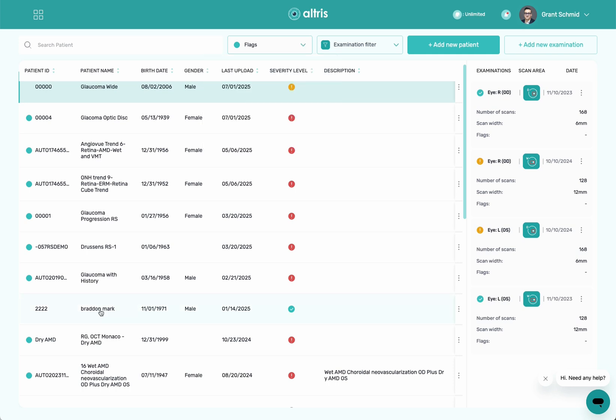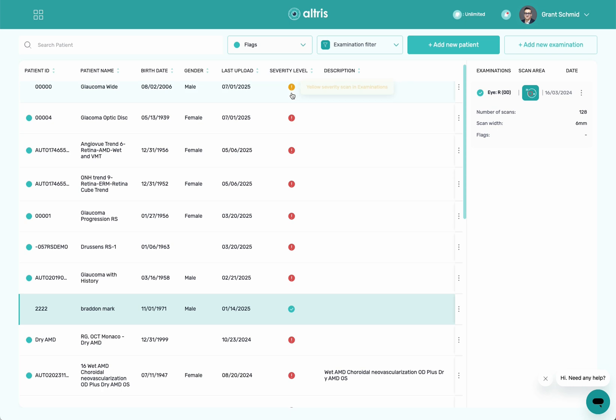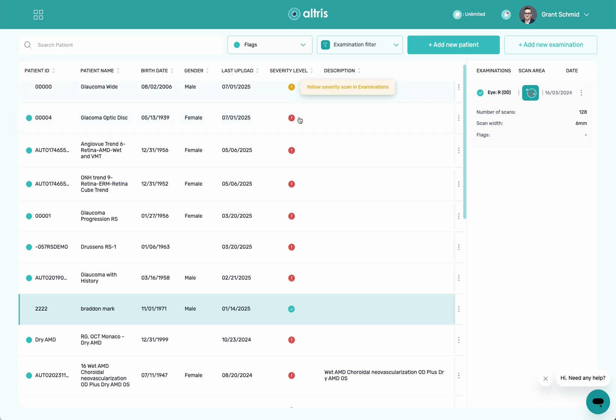Now I'm going to click on this patient here. Quickly, if there's pathology: red is severe, yellow is moderate, green means none.